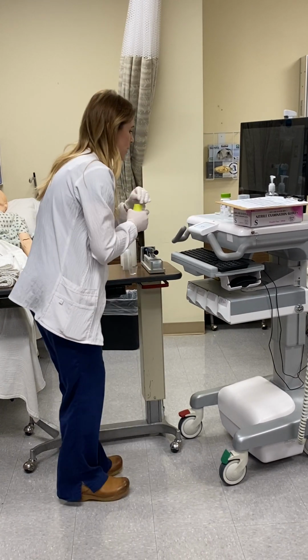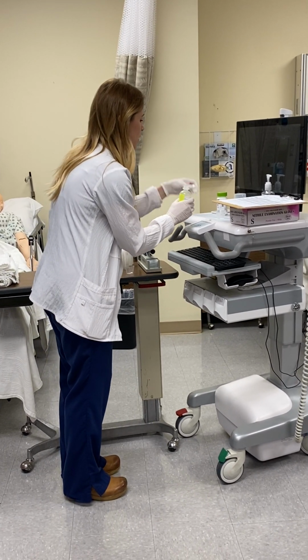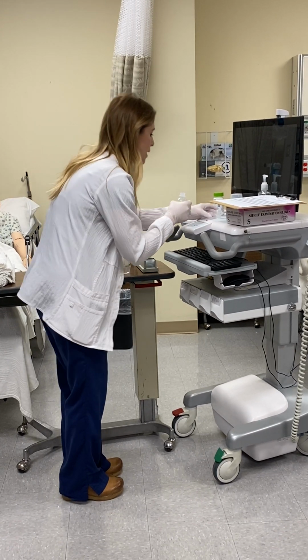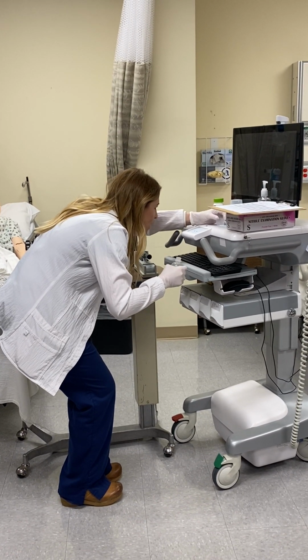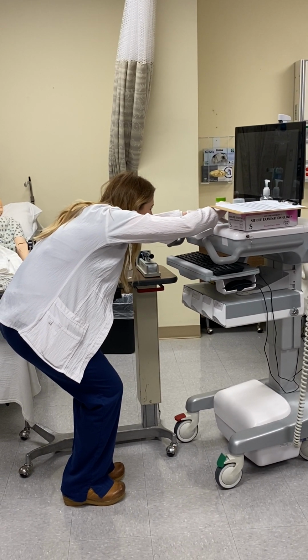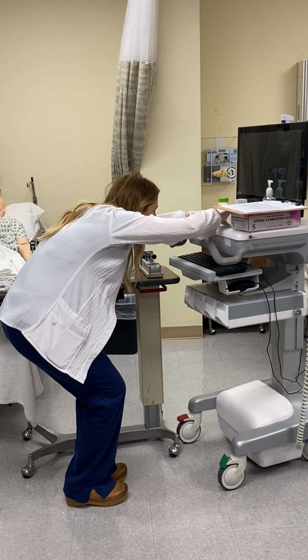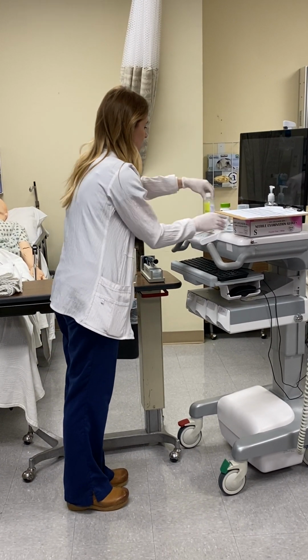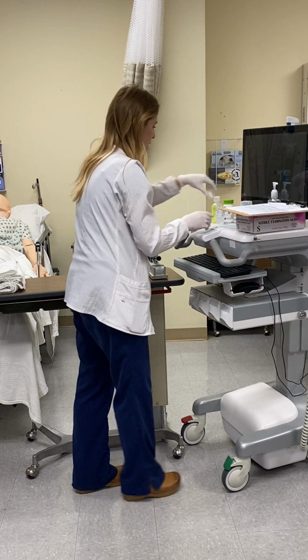Okay, so I'm going to go ahead and open this medication. I'm going to put the label in my hand so I don't pour it onto the label and accidentally mess up the label. I got to get eye level with it, and I'm going to get 30 mLs in here. All right. So that was my second check. I got both of those like I need them.